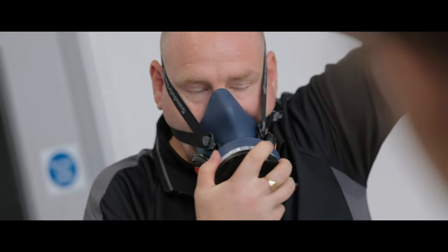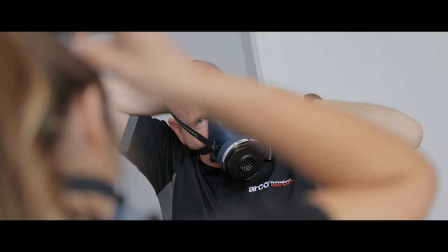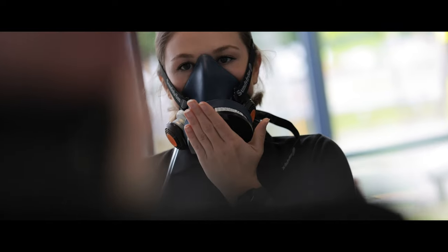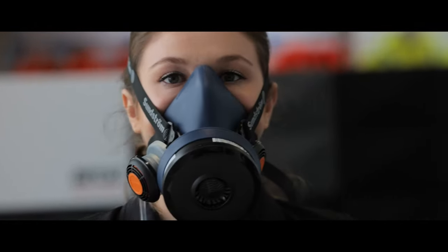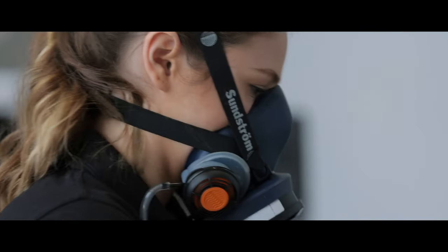Quantitative fit testing is used for all tight-fitting and close-fitting respirators, including disposable masks, half masks and full face masks. A port-a-count machine is used to detect whether airborne particles are leaking into the mask through a gap in the seal before providing a pass or fail result. This scientific method is recognised to be the most accurate.